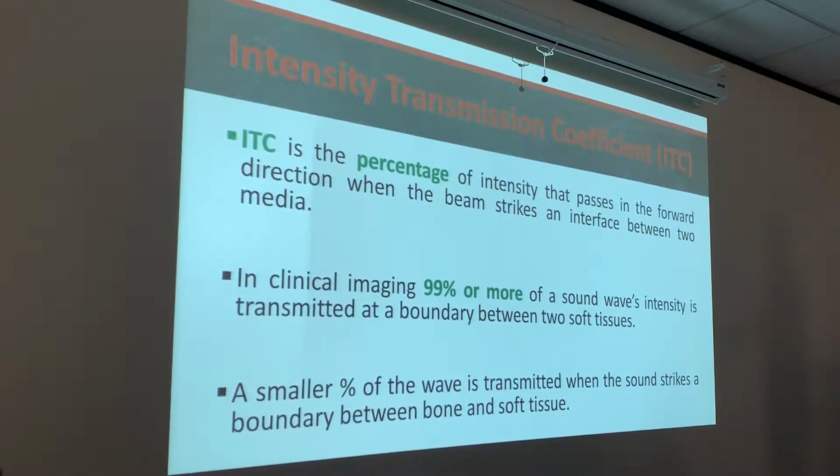Okay, because we're talking about transmission right now. The sound's not going to be able to go through it. Shadowing. So why is it black? Because if no sound is penetrating, you can't get a returning echo back. That's why it's black. So because it's solid, you get the shadow? Yeah, because the stone is absorbing that sound.